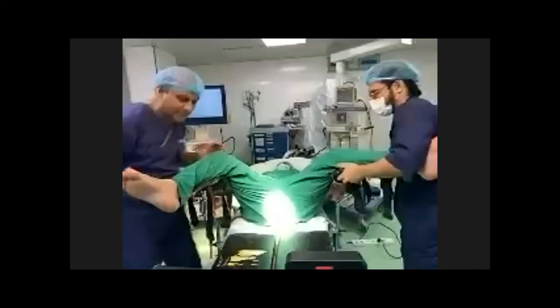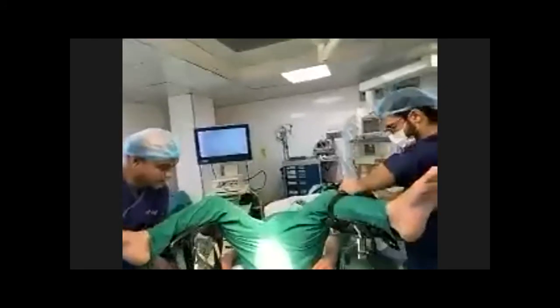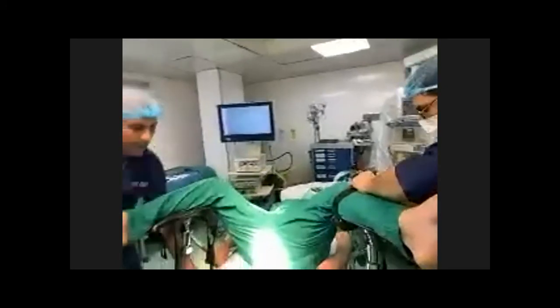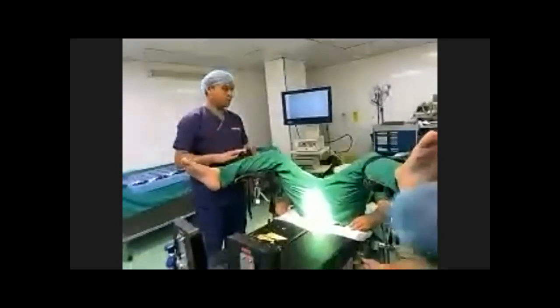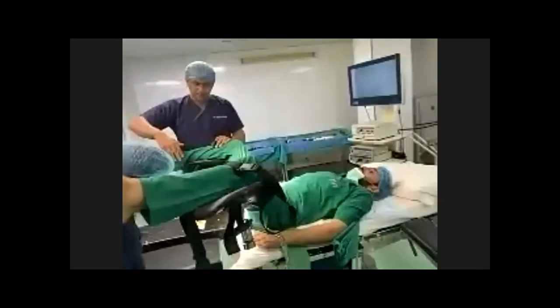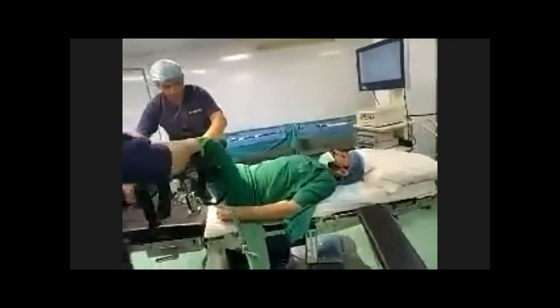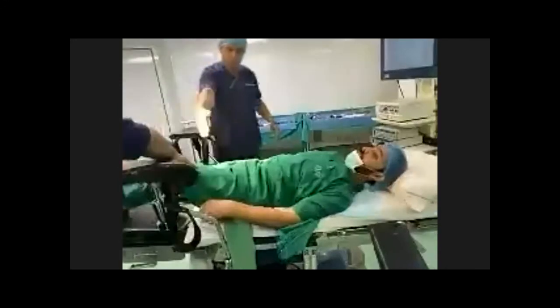So here we will put the patient in the lithotomy position, and we perform the laparoscopy here, and we will detach these parts of the table, and we can do a lithotomy position. Just attach them. You can put them back and you can go up. Okay. Remove these lithotomy poles.